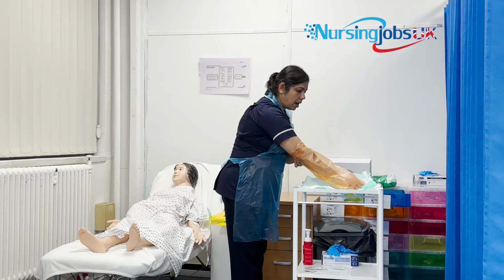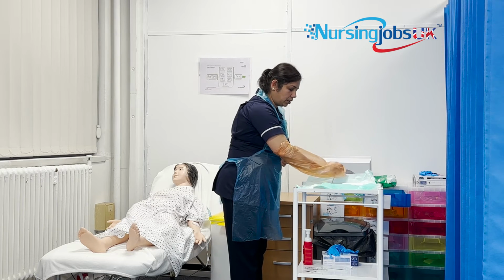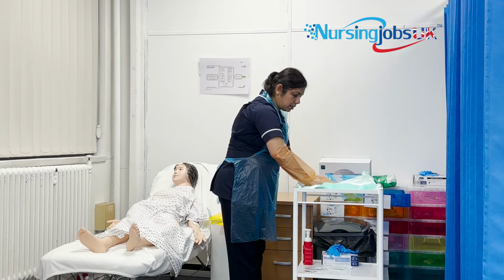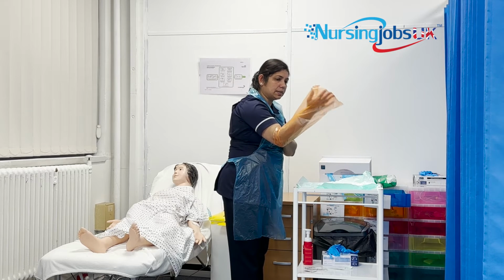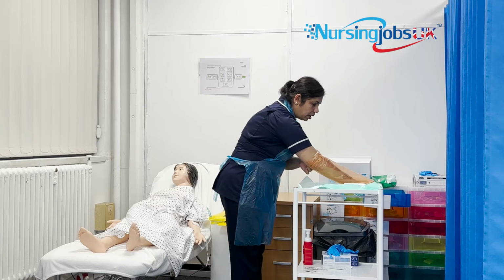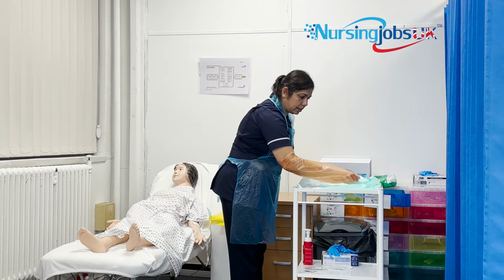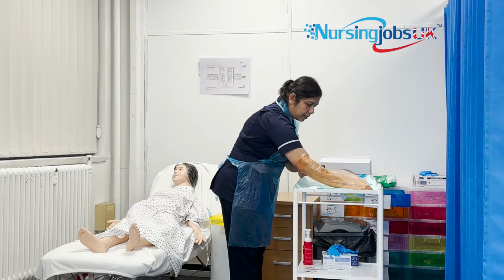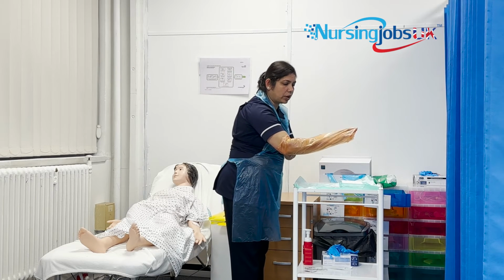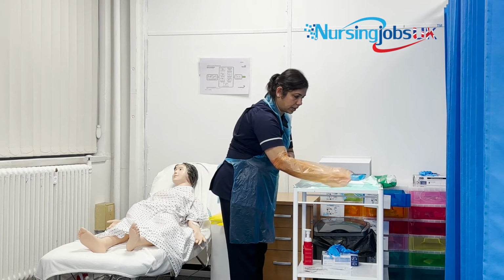Now you need to arrange your dressing bag. Okay. So make sure you can take out everything, and while it's completely sterile now, you will be able to touch anywhere. So make sure you straighten all your dressing bag correctly like this, but make sure your orange part is not going outside the sterile field either.